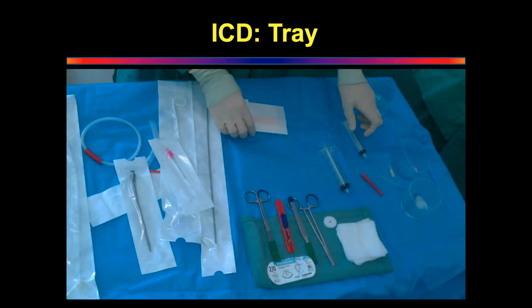that the guide wire doesn't get pulled. And after that, you increase the skin incision, put the track dilators. Excellent. I want you to understand this, that if you do not increase the skin incision, the track dilator will never go. You actually have to make a cut on the skin.